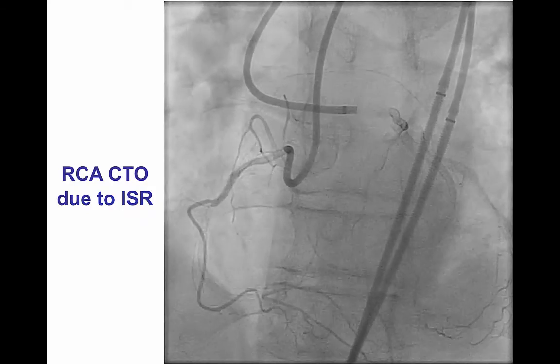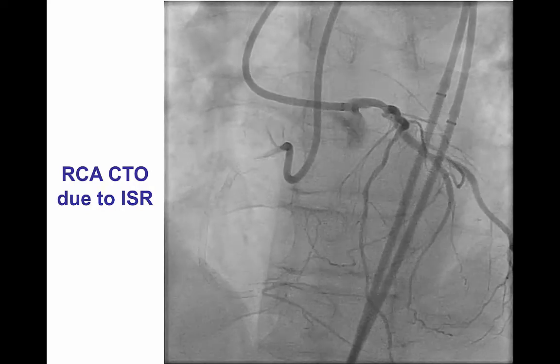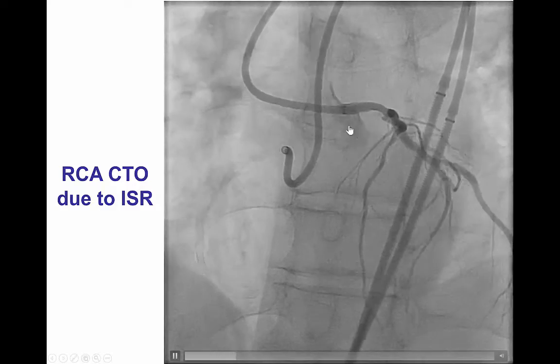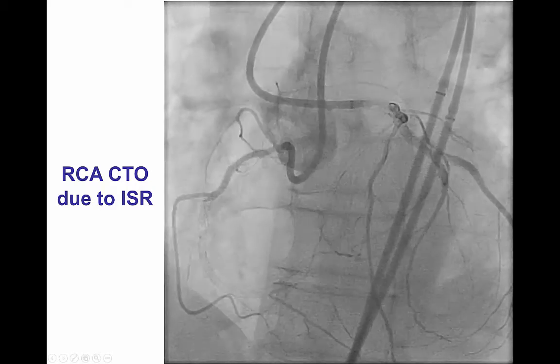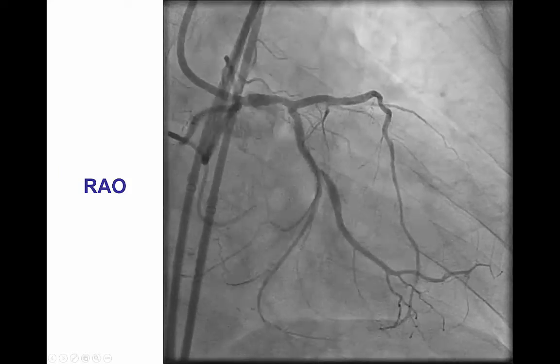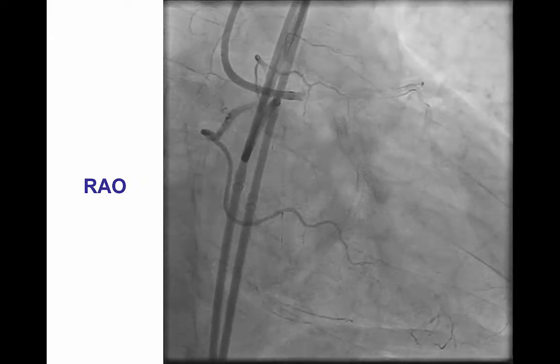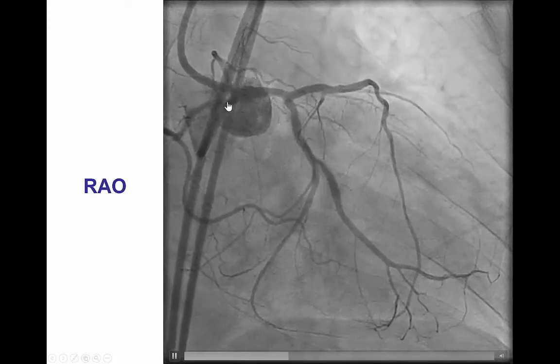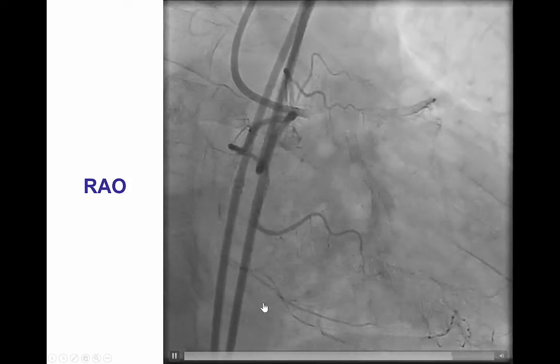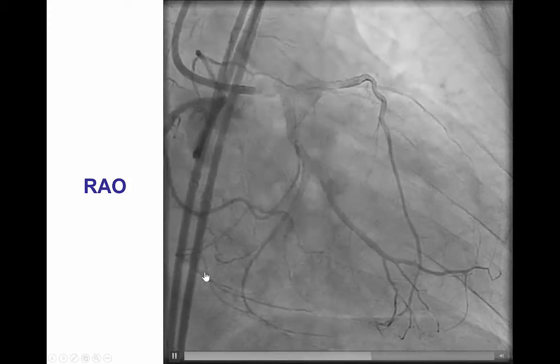Coronary angiography demonstrated in-stent occlusion of the right coronary artery inside the previously deployed stent, whereas the left system did not appear to have significant stenosis, despite the presence of multiple stents. The previously placed stent in the right coronary artery was fairly extensive, from the ostium of the right coronary artery all the way to the crux.